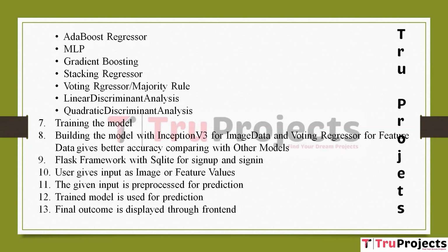QDA is a generalization of LDA that allows for different covariance matrices for each class. It's used when the assumption of equal covariance matrices in LDA is not met. QDA can be applied to complex data distributions in sleep apnea prediction.